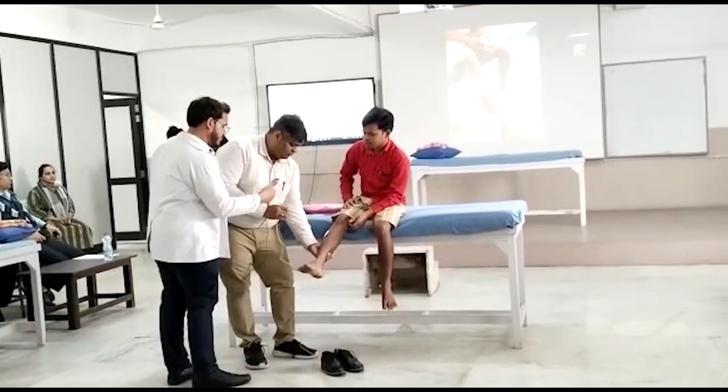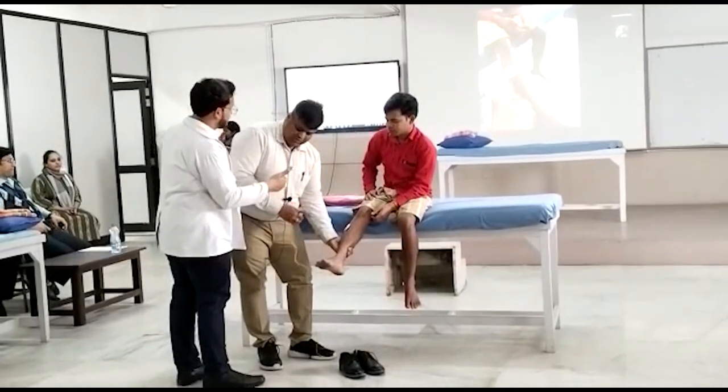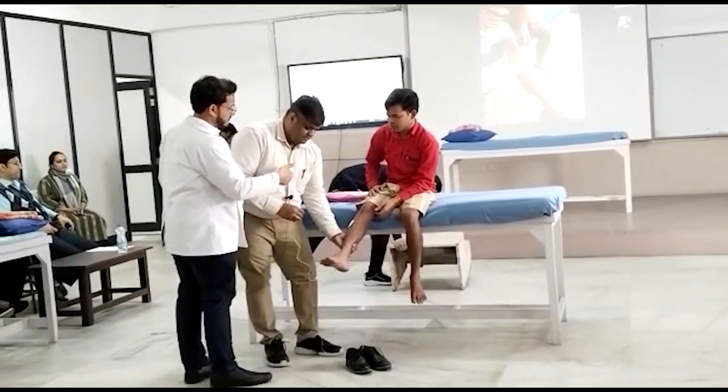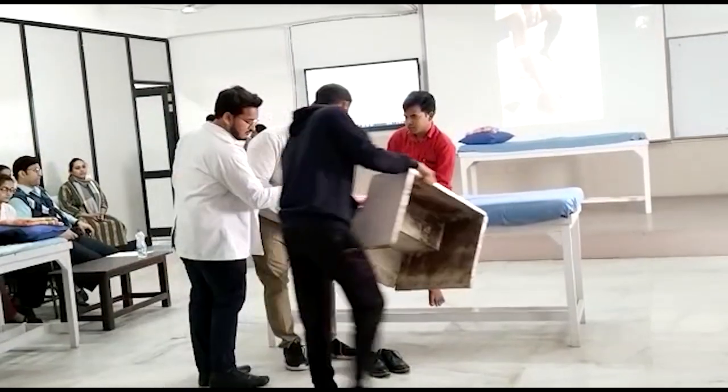Relax your foot — don't try to move your foot, just let your foot go. Relax. Very good. If you can see now, the foot is lifting up slowly. Okay, now you can see the dorsiflexion.